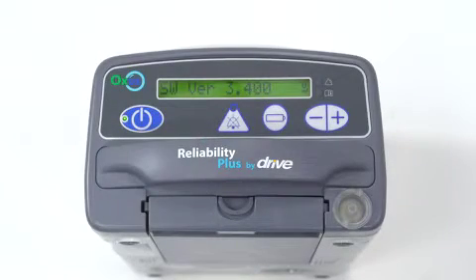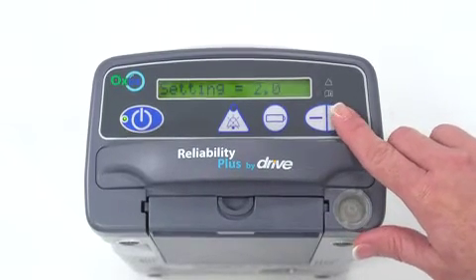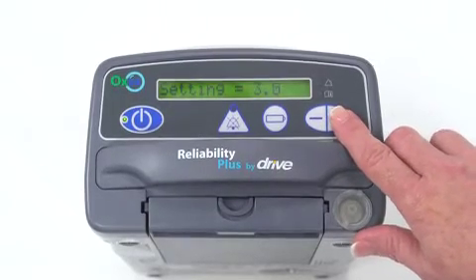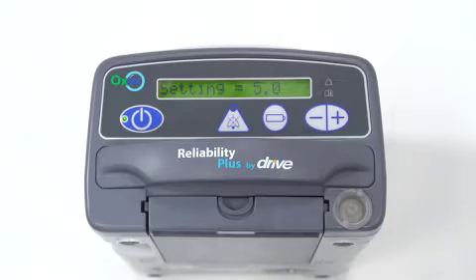Using and understanding the Oxus is simple. Its full text message alerts make comprehension of the alarms and maintenance schedule as easy as reading the display screen, and the simple touch of a plus-minus button allows you to choose from nine different oxygen flows, dispensing the equivalent of up to five liters per minute.